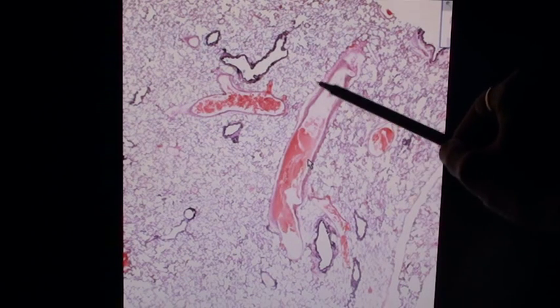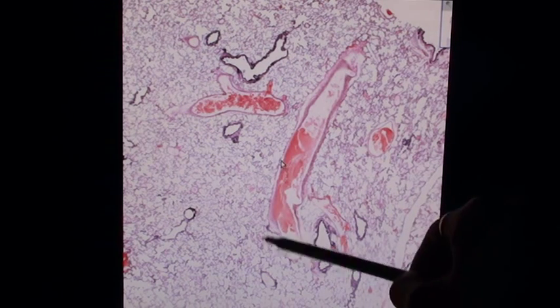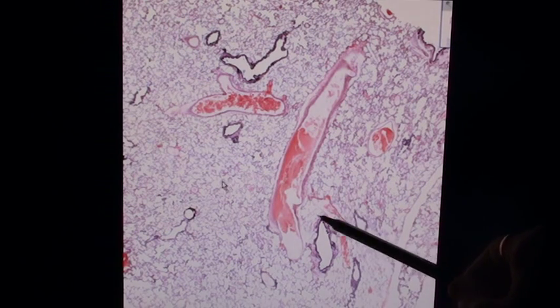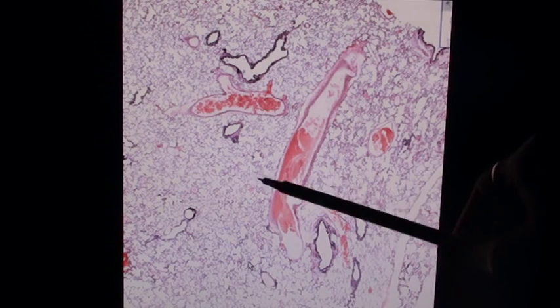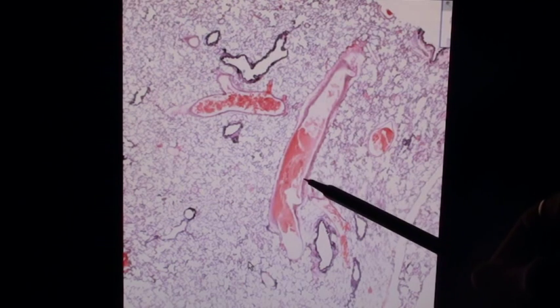They grow from a pretty thick sized pulmonary artery down to smaller arterial branches, and the veins have thinner walls. Remember that the pulmonary artery system has a lower arterial pressure, so the arteries are not as strong as you expect them to be.